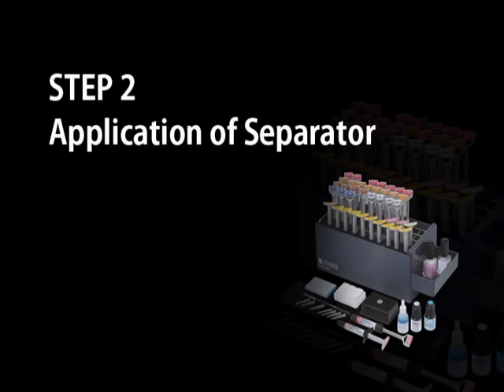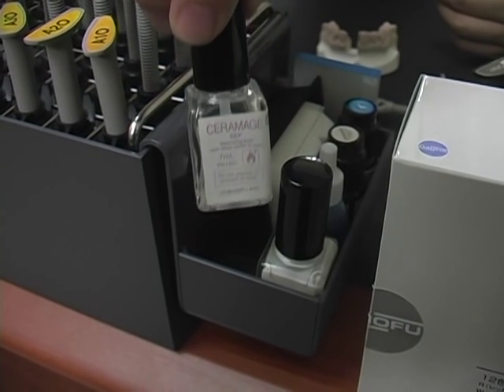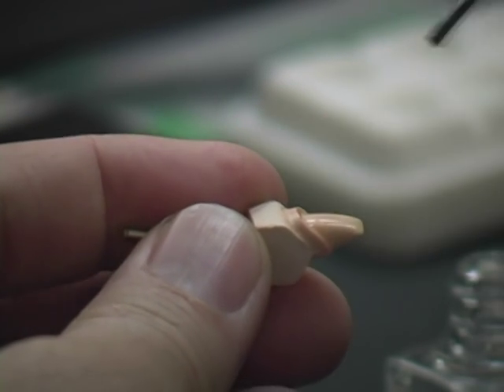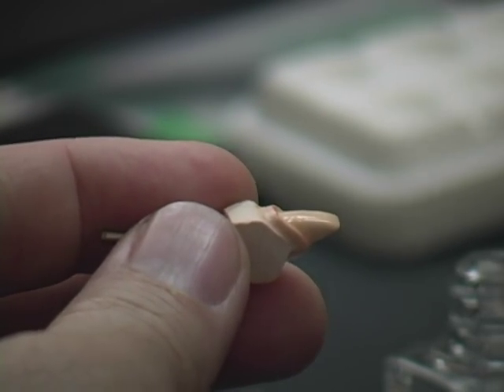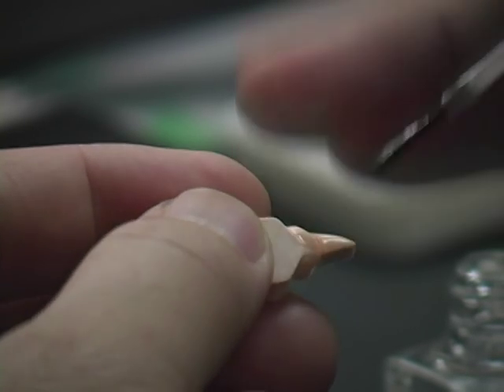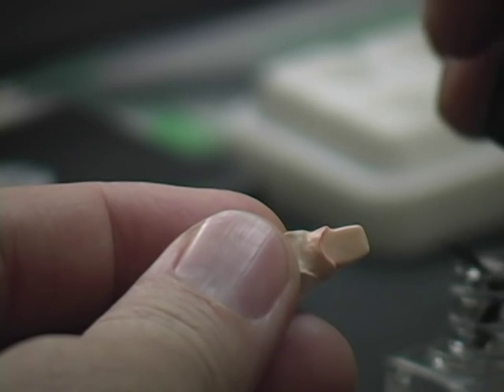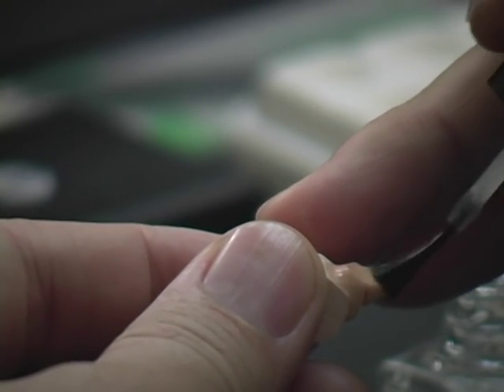Application of separator. Ceramage Sett is used next to ensure easy separation of the restoration from the die. Apply an even layer of Ceramage Sett on the entire surface and let it dry.